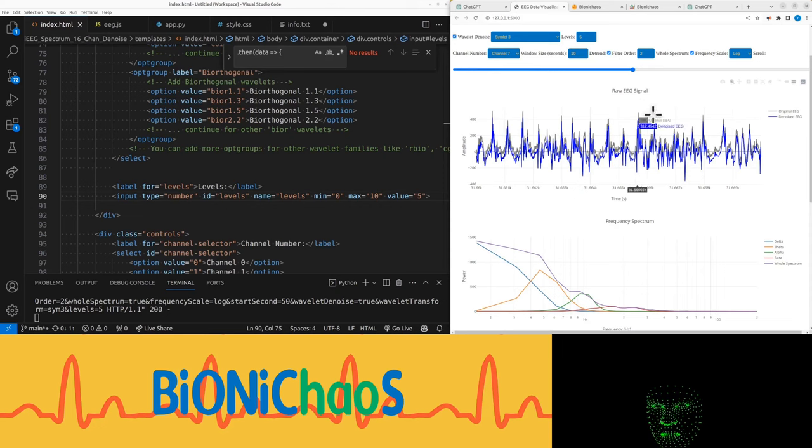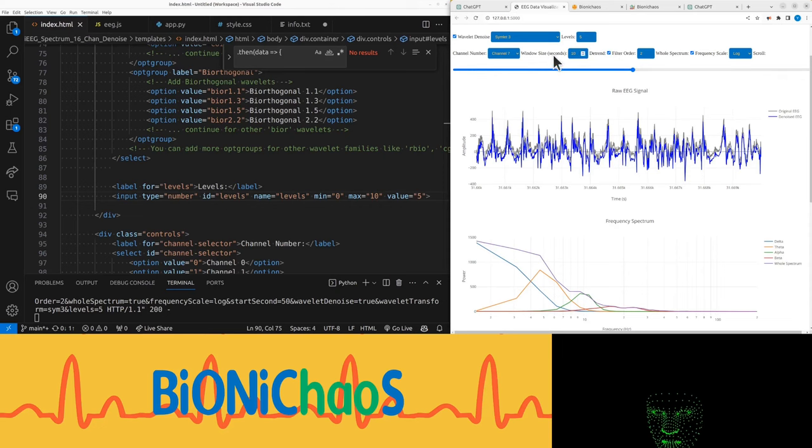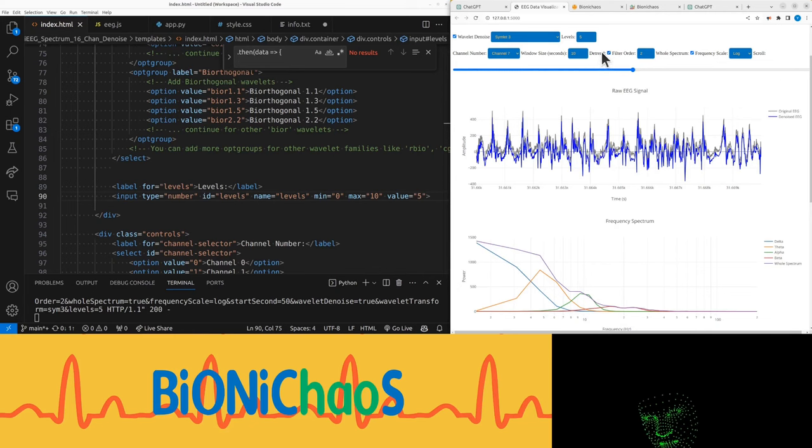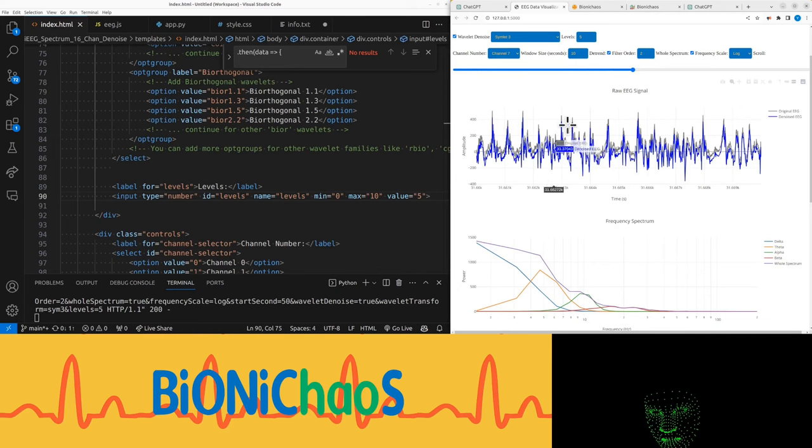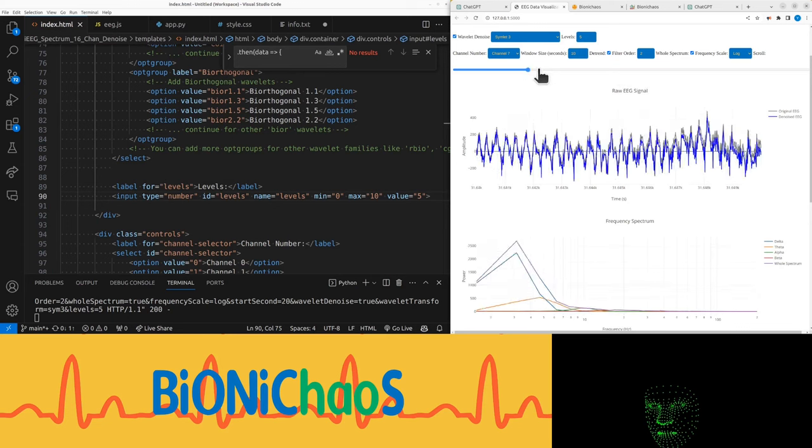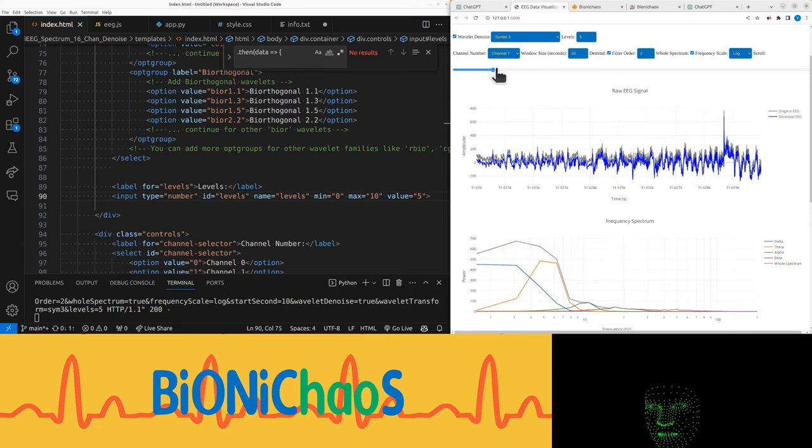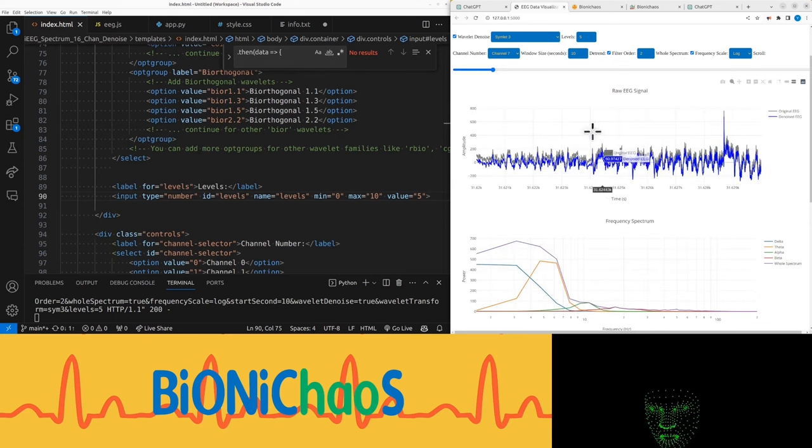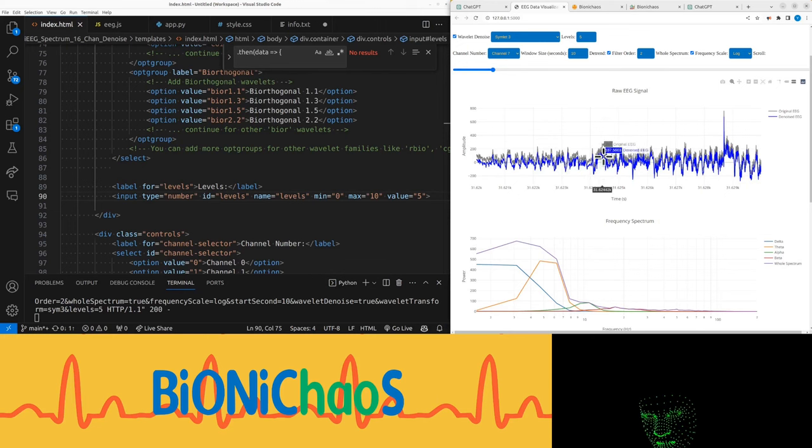Now, the original is also before the detrending, and the blue one is detrended and Wavelet Denoised. That's why you see the offset, the DC offset.